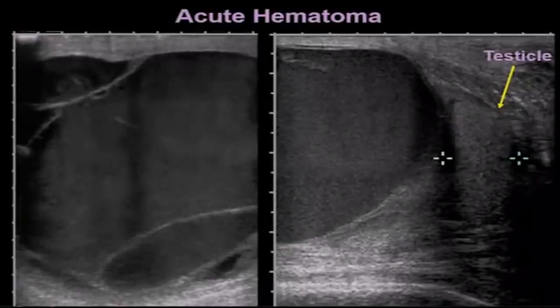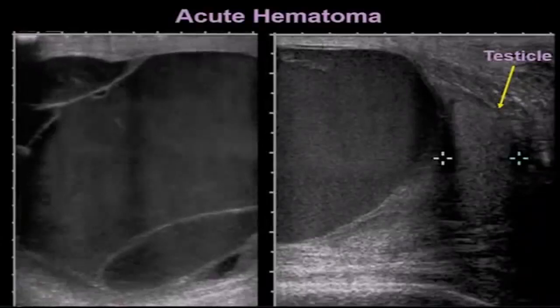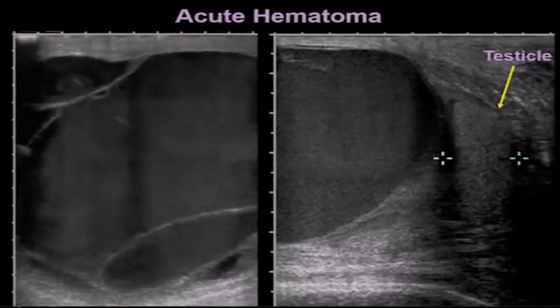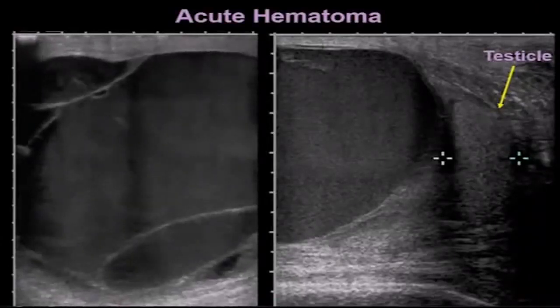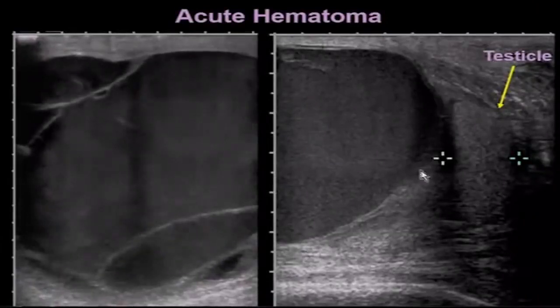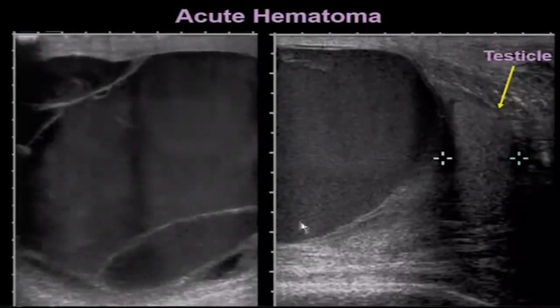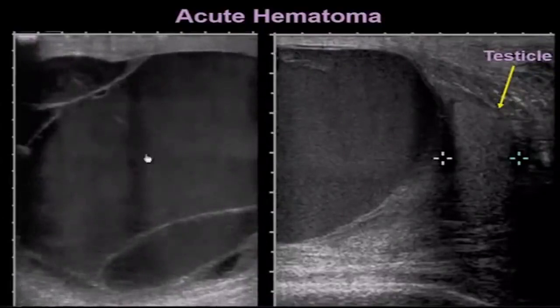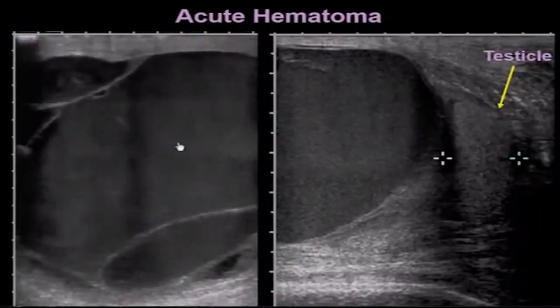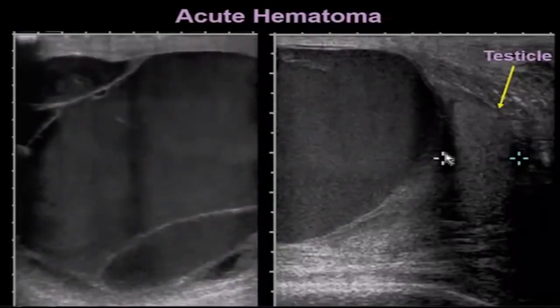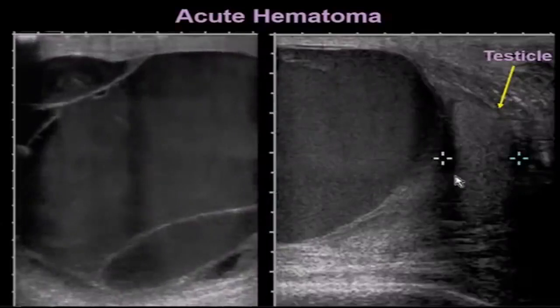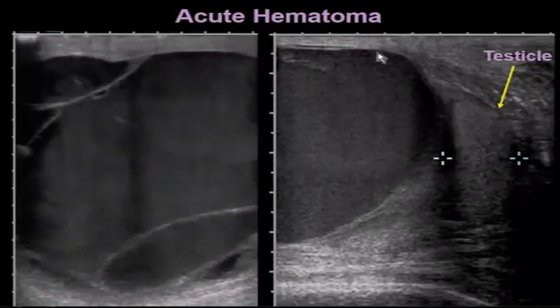Here's a patient who had an acute hematoma. The scrotum was markedly enlarged after trauma, and we saw this large collection in the upper portion of the scrotum — a fluid collection that moves with the ultrasound beam. The testicle was compressed inferiorly by this very large hematoma.